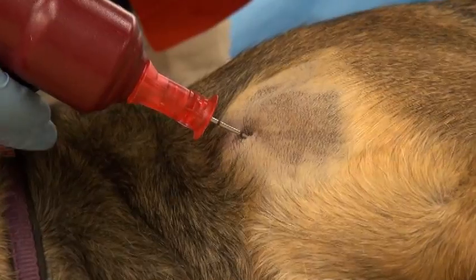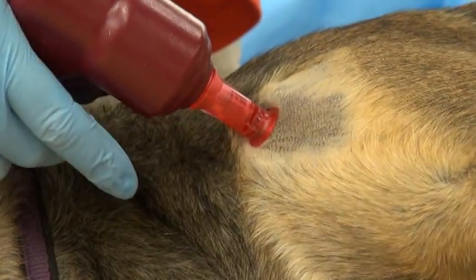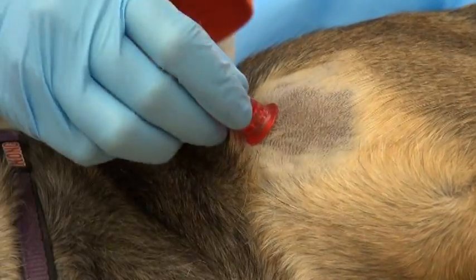The needle is pushed up against the desired location on the bone, and then the drill is activated, rapidly seating the needle.